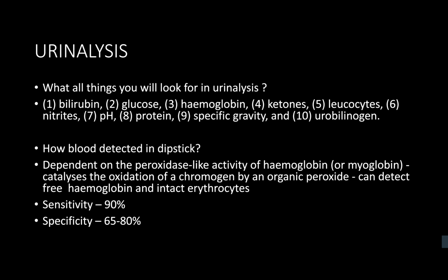Okay. Regarding the blood, what is the mechanism by which the blood is detected? This is detected through hemoglobin producing the enzyme peroxidase, and this causes an oxidative reaction with orthotolidine, which is the substrate on the strip, and this induces cell lysis with a resultant color change on the strip to blue or green.